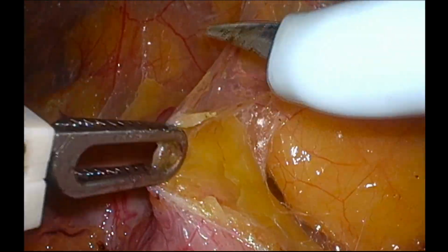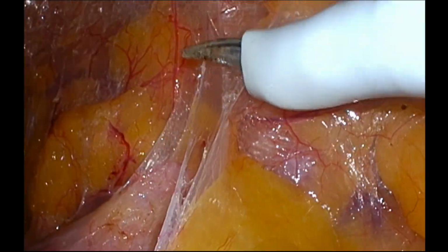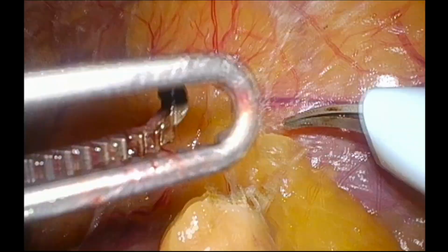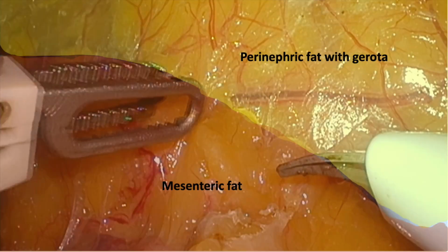During colon mobilization, a clear plane can be identified between the colon mesenteric fat, which has more of an orangish hue, and the perinephric fat, which has more of a lemon yellow hue.